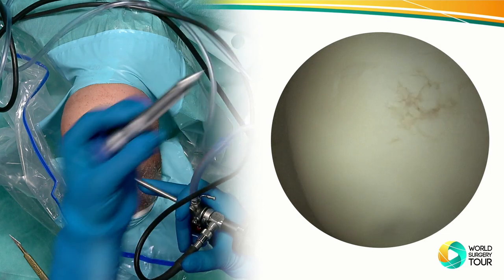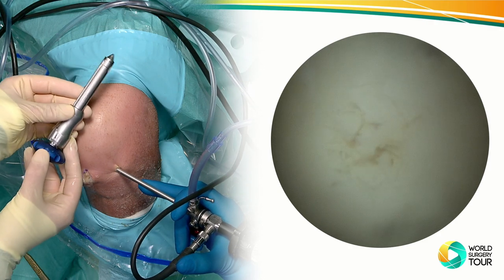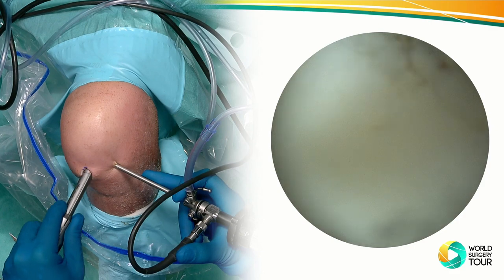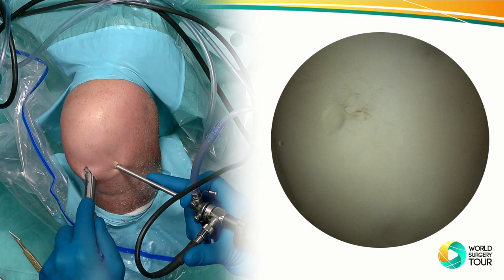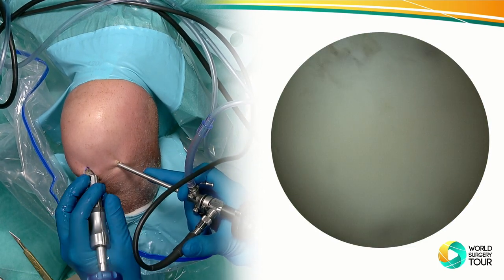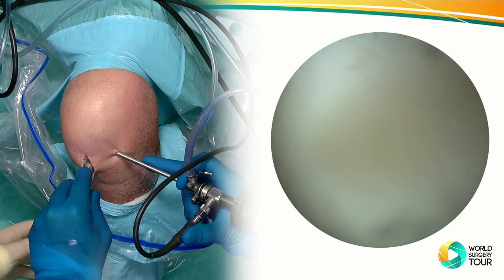This is this cannula. If you can see it, I'll just bring it in there. Or can you show it? Okay, perfect. So I have a trocar that allows you to bluntly bring in the device. Here we go. And now it's important to really position it correctly into the joint.